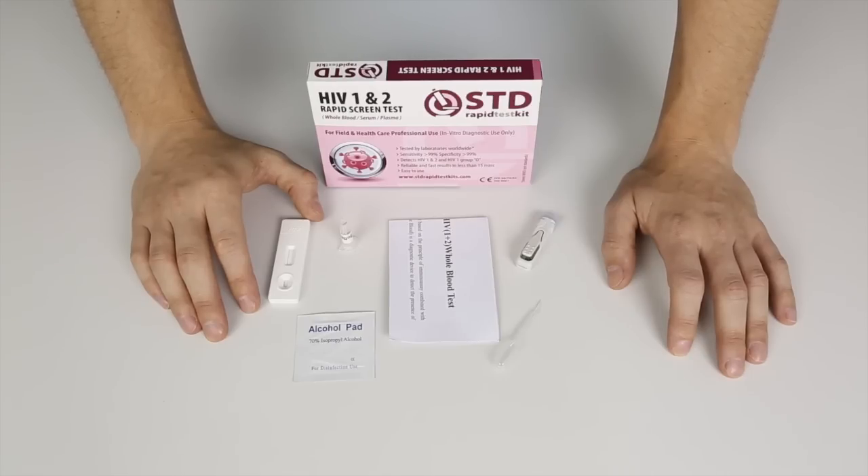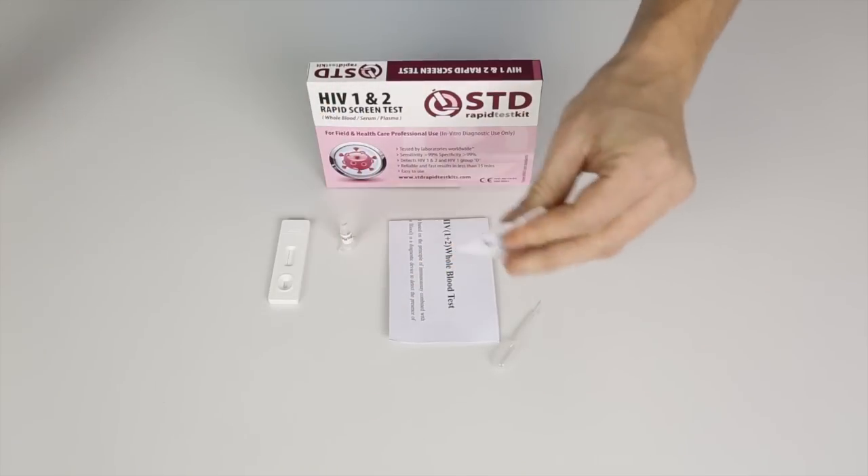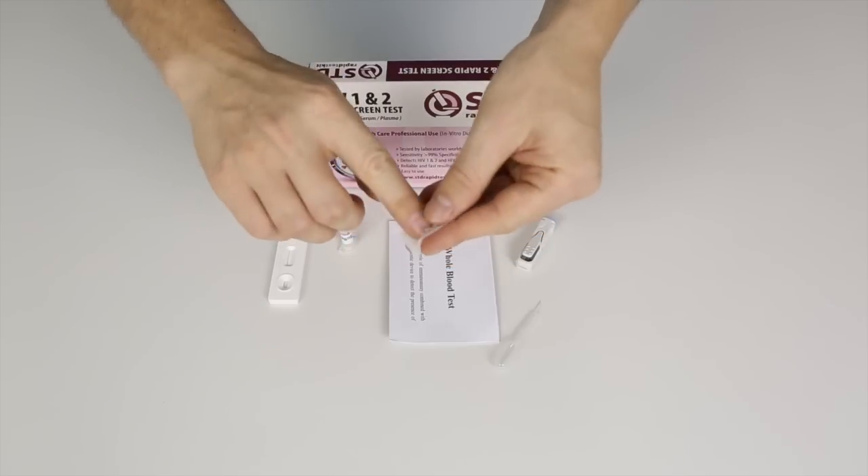What I'll do first is use the sterile pad to clean my finger with. I'll tear it open like this, take it out, and clean my fingertip.